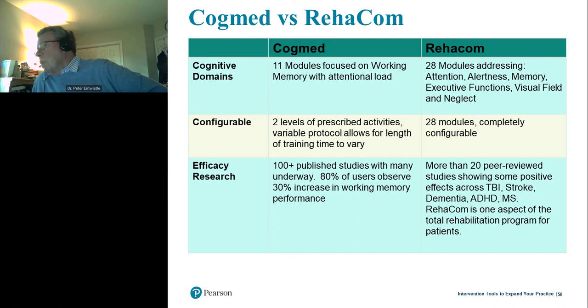So how long should the exposure be? Do they need directions or not? Is there a time limit? All of those things can be changed. And as I like to describe it, it's a little bit like having a Mercedes with all the bells and whistles. It gives you the opportunity to adjust the parameters for your clients based upon what you think they need or how they've been able to manage.